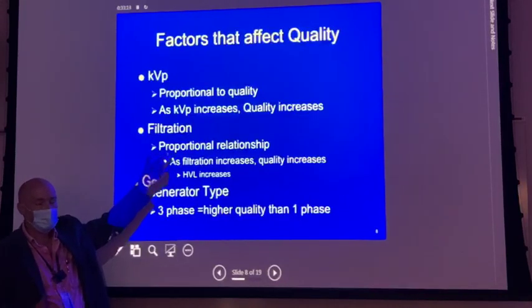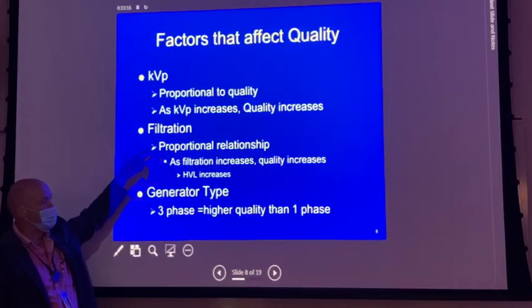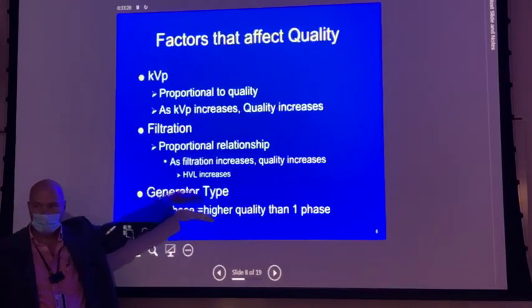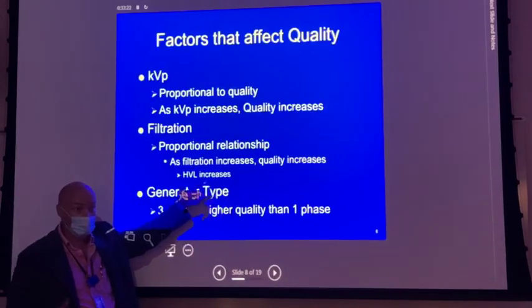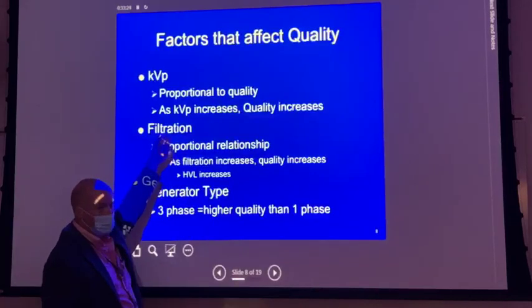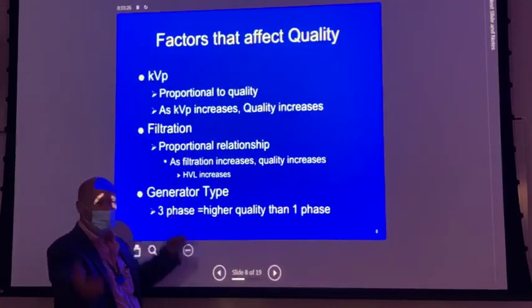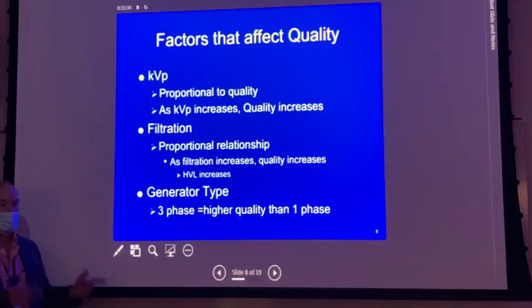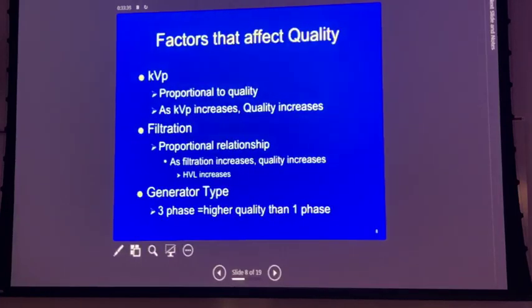We don't have as many of those low energy x-ray photons created with three phase as opposed to single phase, and even the ones that are get absorbed inside of the filtration. So the emission from the x-ray tube is of higher quality and higher quantity. The beam energy with three phase and with high frequency is much higher than it is with single phase.